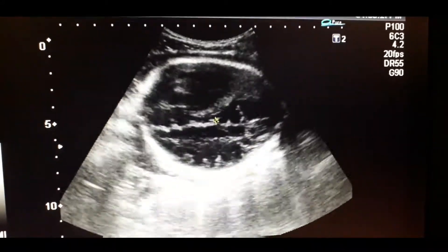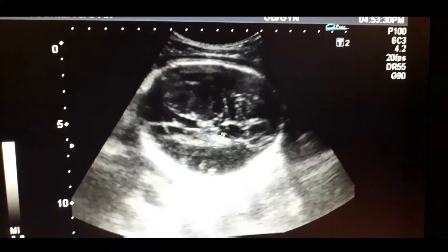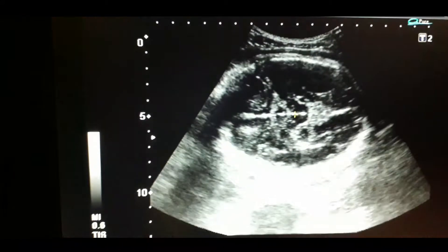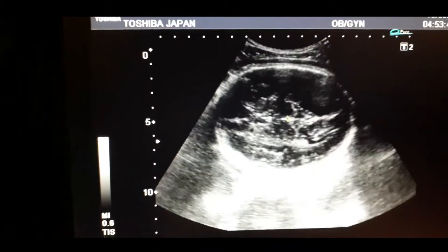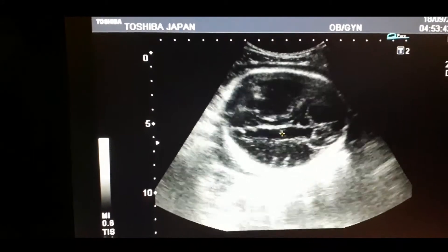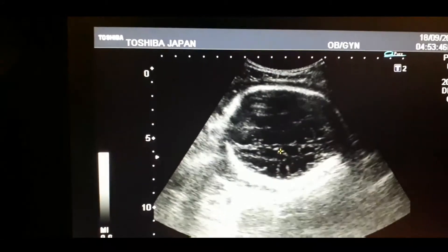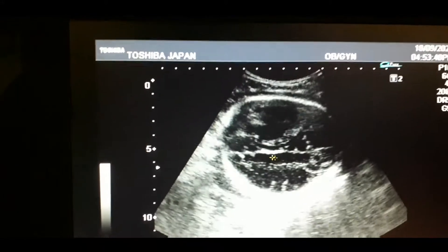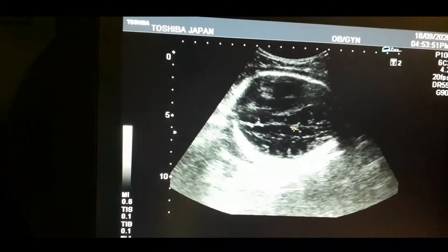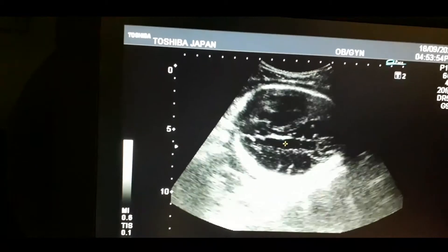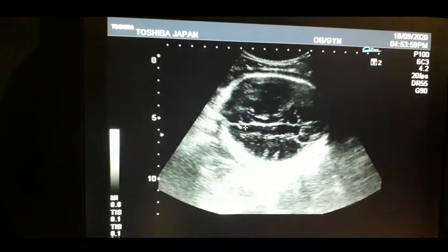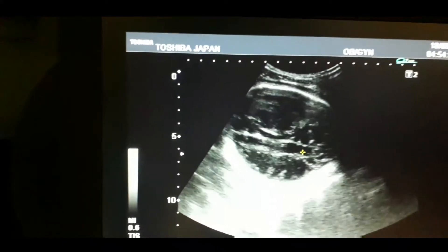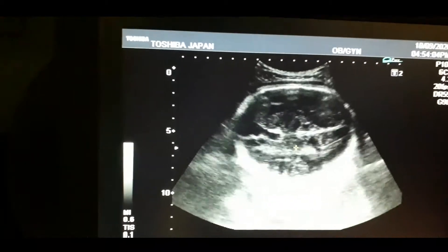Now I will try to locate the transventricular plane. This is the transventricular plane. This cavity-like structure is the lateral ventricle. It is the ventricular plane — that is the lateral ventricle. This is the anterior horn and this is the posterior horn.